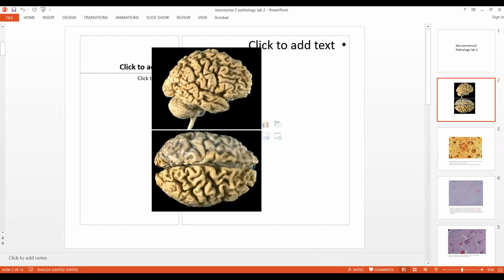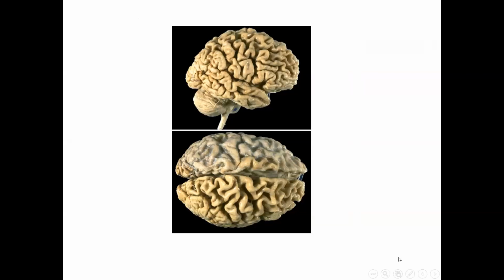So the first picture is a picture of a brain that is abnormal. What is abnormal in this brain? صار في widening of the sulci and the tapering of the gyri. صاروا الجيري شوي مدببين أو حادين. And the appearance is consistent with brain atrophy.